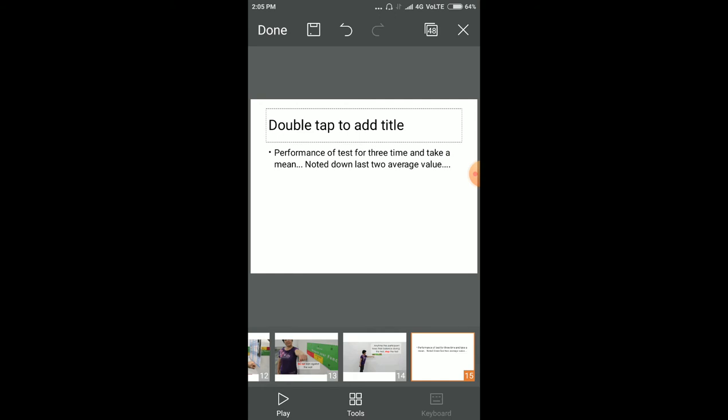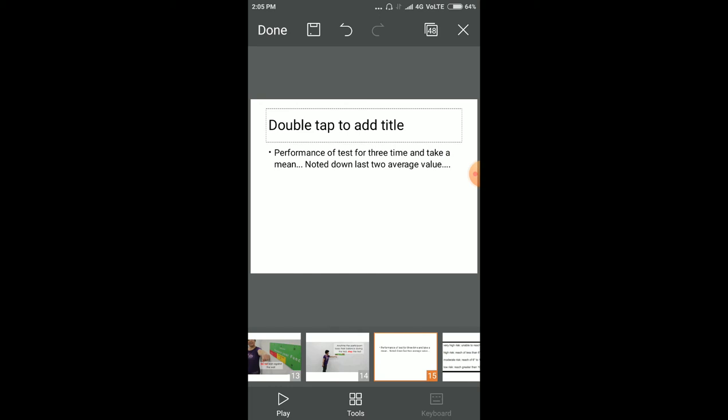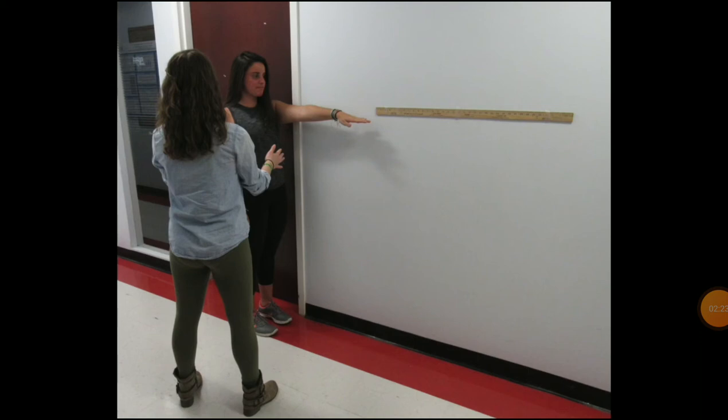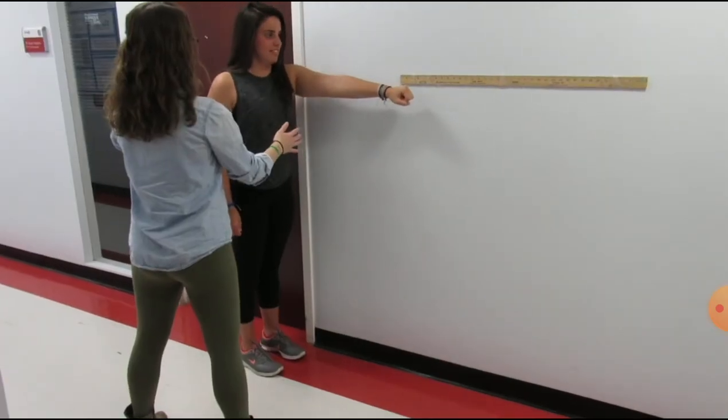Now we see the video. Notice the patient's position near the ruler with feet apart and weight equally distributed on both sides.